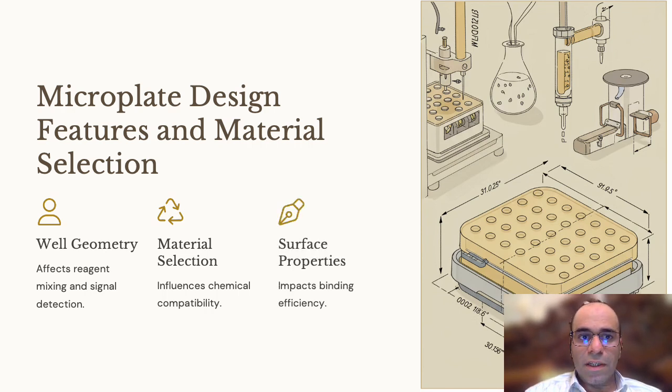And the last part is surface properties. Surface properties impact binding efficiency and specificity of biomolecules. High binding surfaces use hydrophobic and or charge modifications to enhance protein attachment. Low binding surfaces minimize non-specific interactions for cell-based assays.